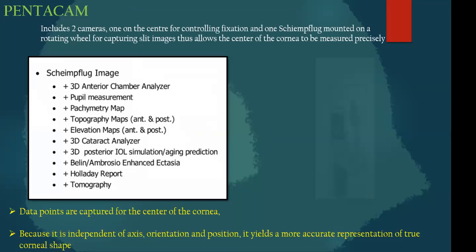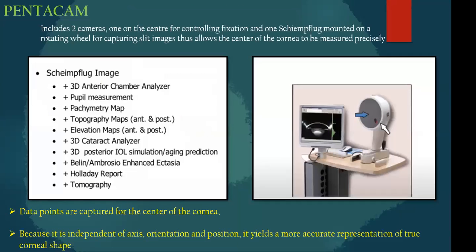So coming to the Pentacam, the Pentacam device includes 2 cameras. One is in the center, as you can see here.